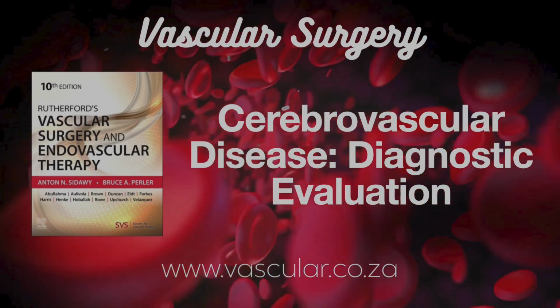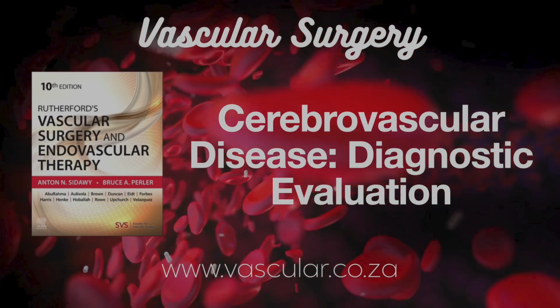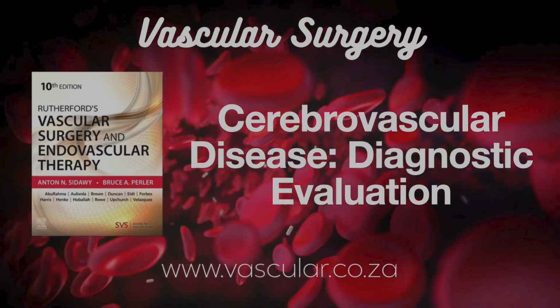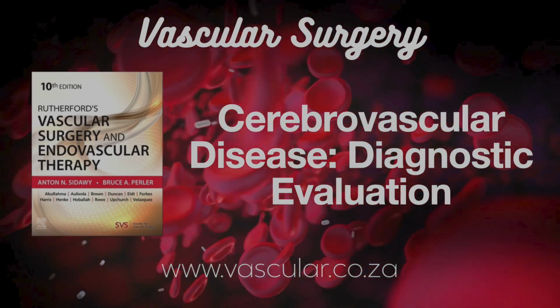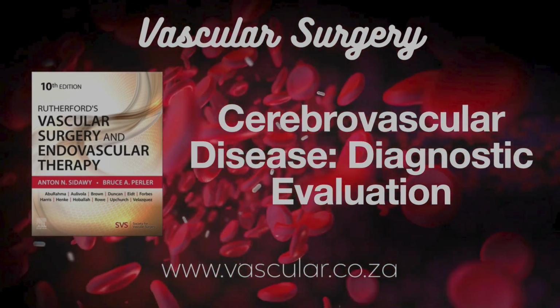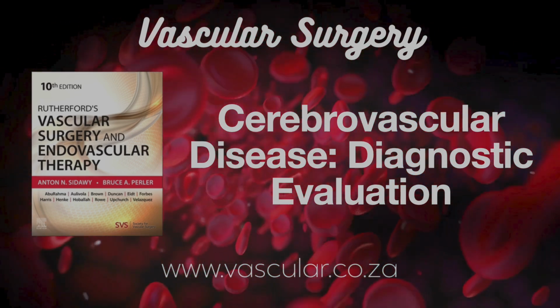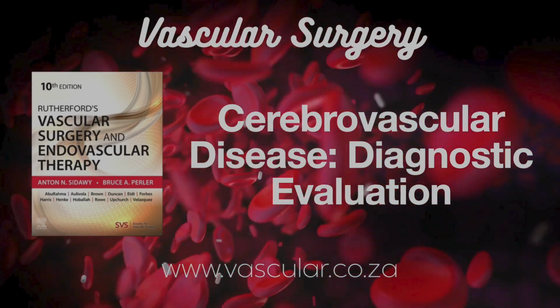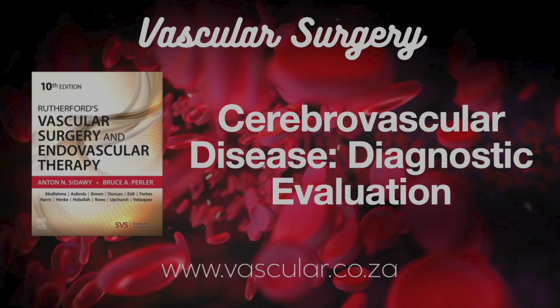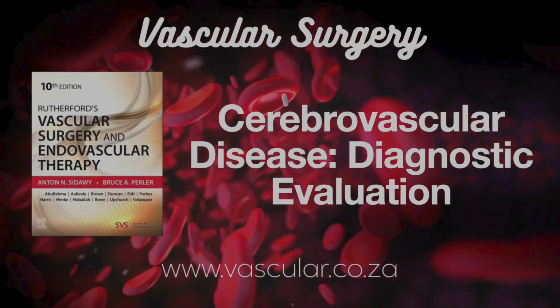And there's evidence linking this to stroke risk, even in people without symptoms. Really? How so? Well, several studies looked at asymptomatic patients with significant carotid stenosis who had TCD monitoring. A meta-analysis combining these studies found something striking. Detecting even one embolic signal during just an hour of monitoring was linked to an almost 8-fold increase in the risk of stroke later on. 8-fold. That's huge. It is.